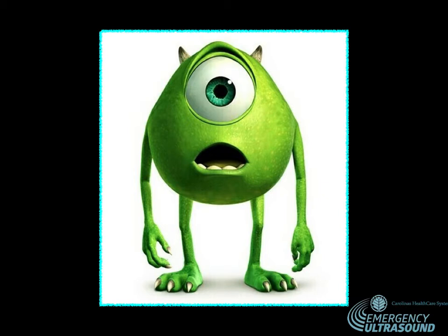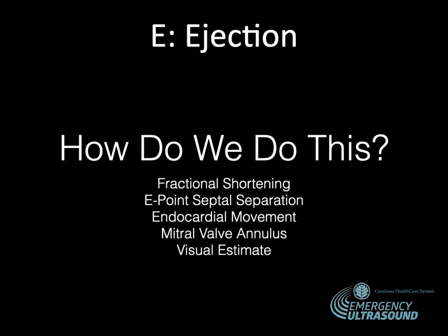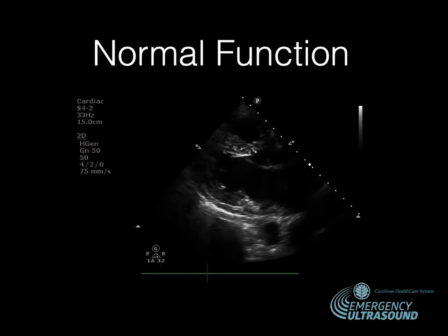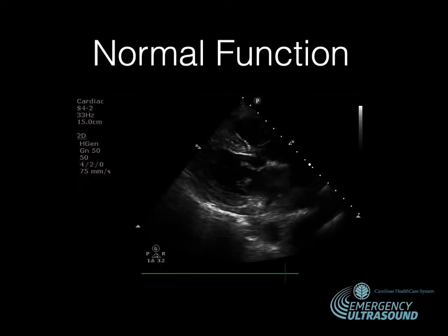We're going to use the eyeball method. With a critical eye, we identify the left ventricle and look at different aspects of how it moves. We're not looking for an exact ejection fraction of 65% or 18% — we're looking for hyperdynamic, normal, moderate, or poor function. To do this, we look for fractional shortening, E-point septal separation, endocardial movement, and movement of the mitral valve annulus to give us our overall visual estimate.